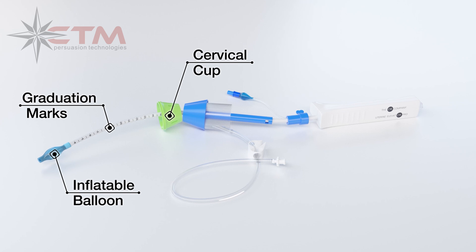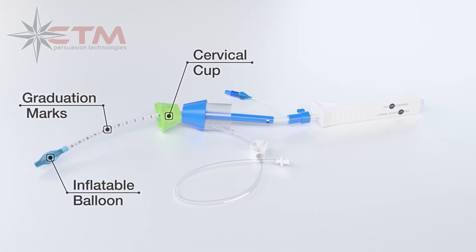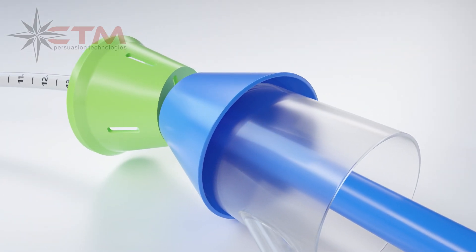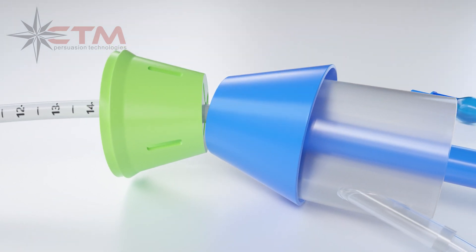In addition to these essential design features, the Uterine Elevator Pro offers advanced design benefits, including a vaginal cup designed with smooth edges to reduce or eliminate trauma to the vaginal vault upon removal.